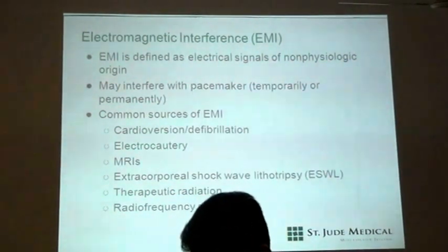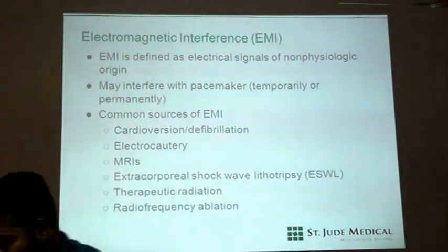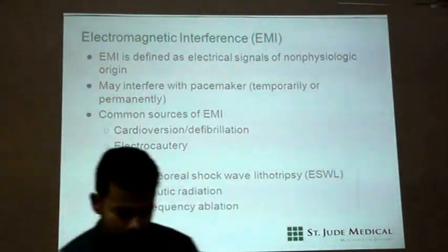Now for other faculties like surgeons who want to operate on a patient with a pacemaker, these slides are very important.